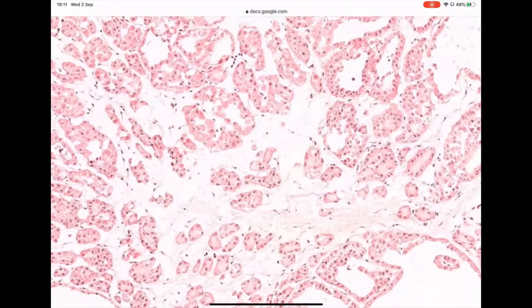Okay, but yes, on the caution side, in real life, some people in some practices will do the CD117 and CK7 and the CD10 as a little panel to make sure they differentiate the three eosinophilic tumors that can come. Of course, I did not include the papillary because this tumor was not particularly papillary carcinoma, but the papillary carcinoma as well can look eosinophilic.